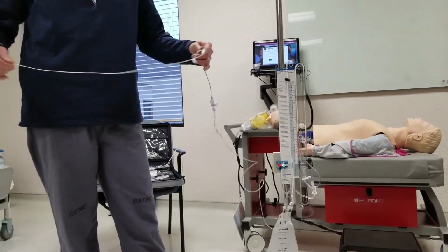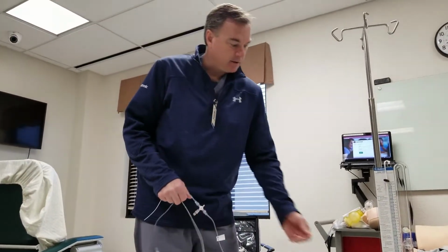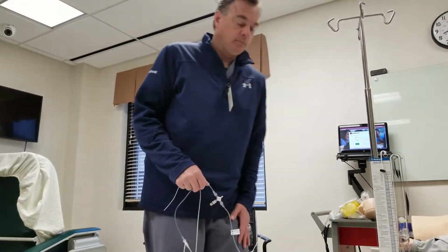This is what's coming out of the patient, and again, the blue line jumps out at you. There's a stopcock here, and then there's a stopcock here.